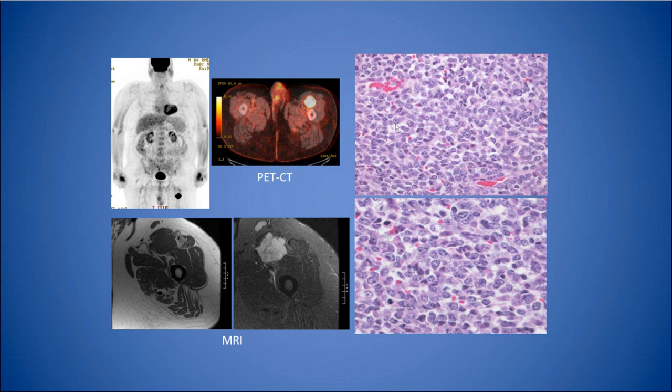There is variability in the size and shape of the nuclei. Some of the nuclei had nucleoli. There were extensive areas of necrosis and a very high mitotic rate. So initially, the workup for lymphoma turned out to be negative, and so of course for carcinoma, which was exactly what they were trying to rule out.